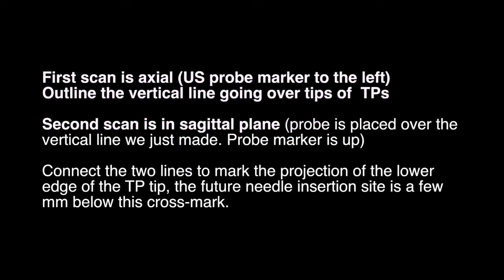Step 2: Ultrasound-guided marking of the required TP tip. The first scan is axial, with the ultrasound probe marker to the left. Outline the vertical line going over the tips of TP. The second scan is in the sagittal plane; the probe is placed over the vertical line with the probe marker up. Connect the two lines to mark the projection of the lower edge of the TP tip. The future needle insertion site is a few millimeters below the cross mark.